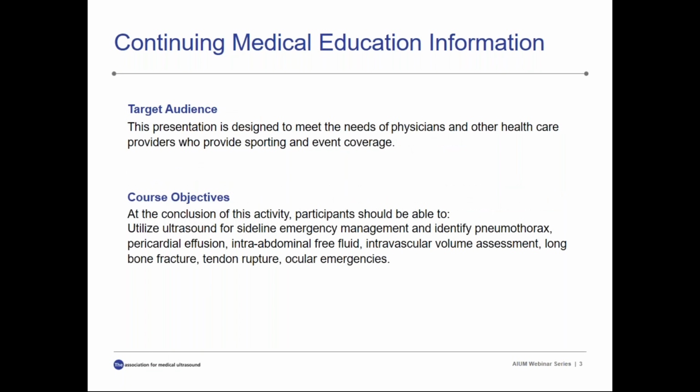By the conclusion of this webinar, participants should be able to utilize ultrasound for the sideline emergency management and identify life-threatening and common sideline emergencies.